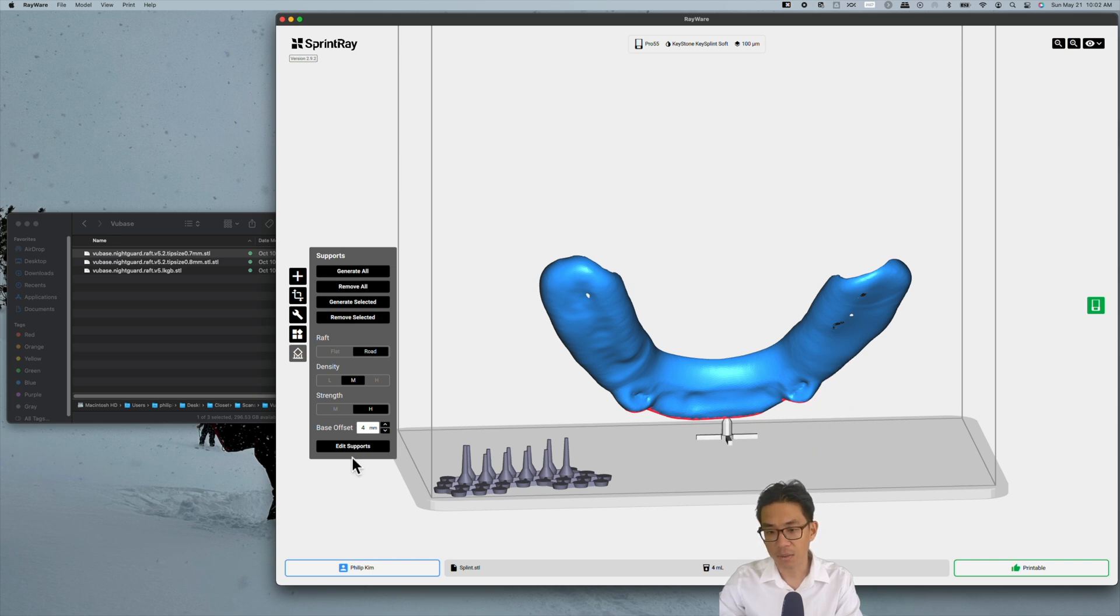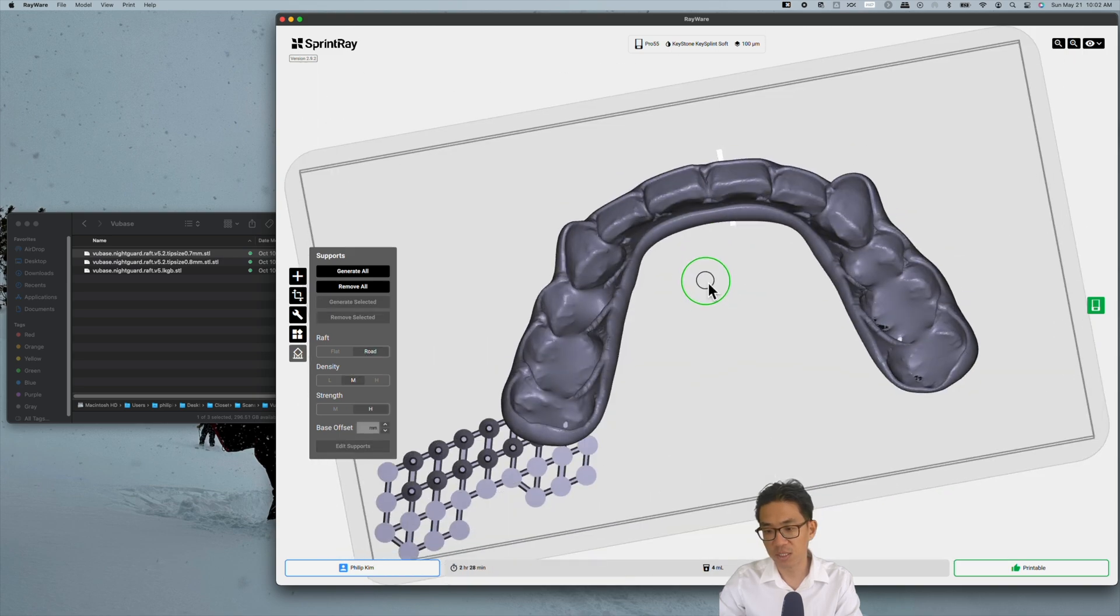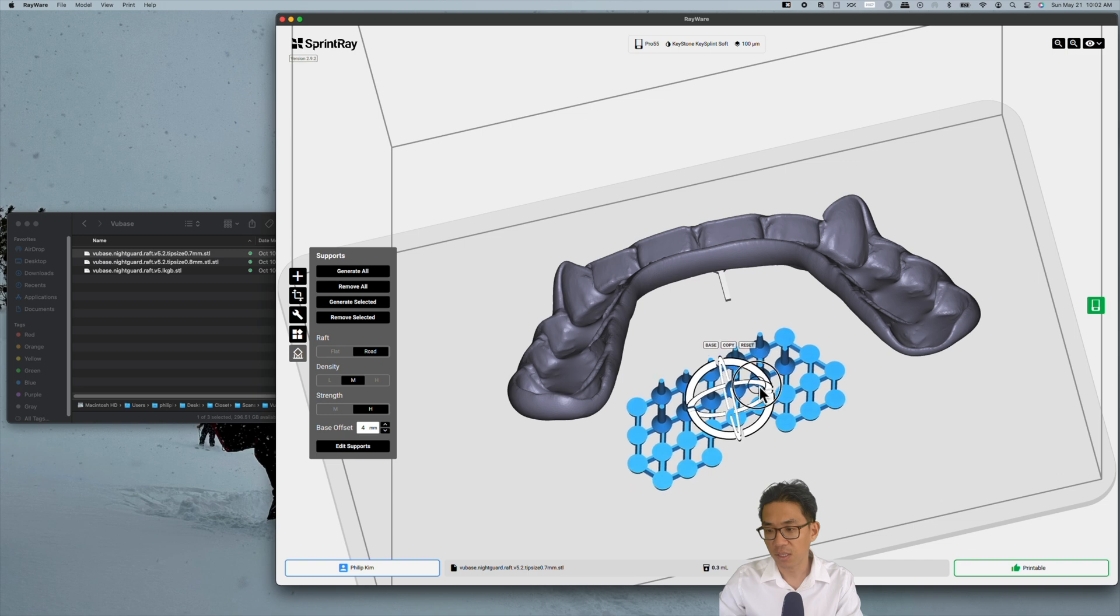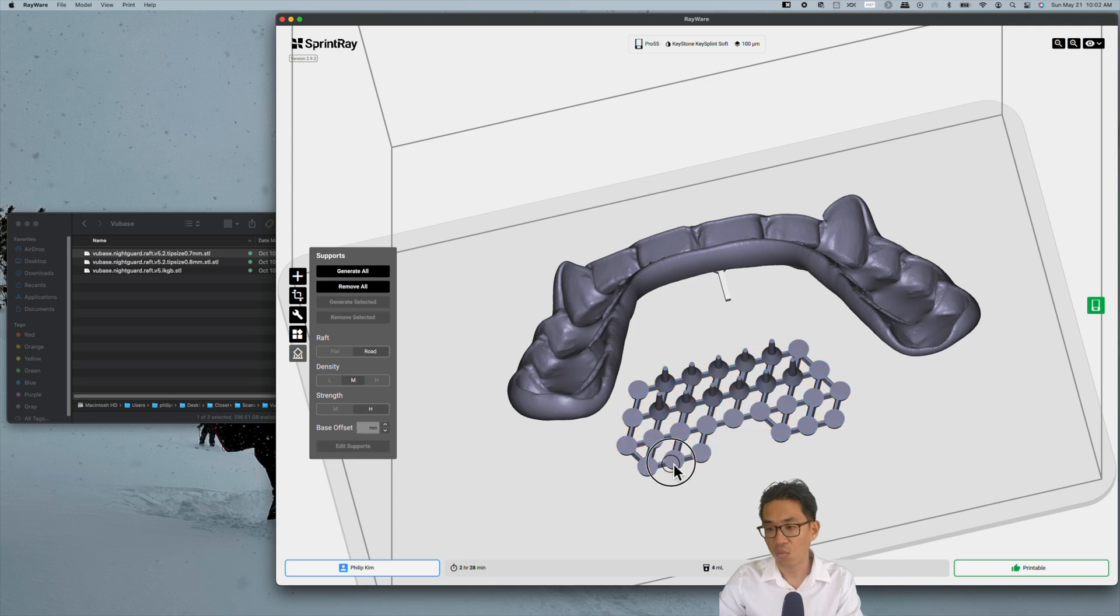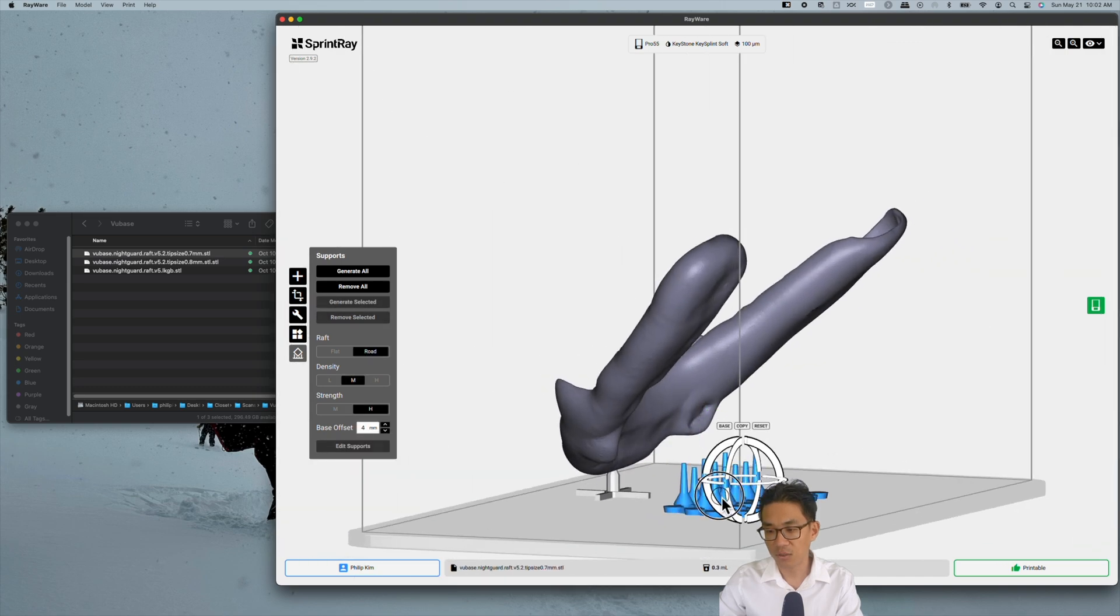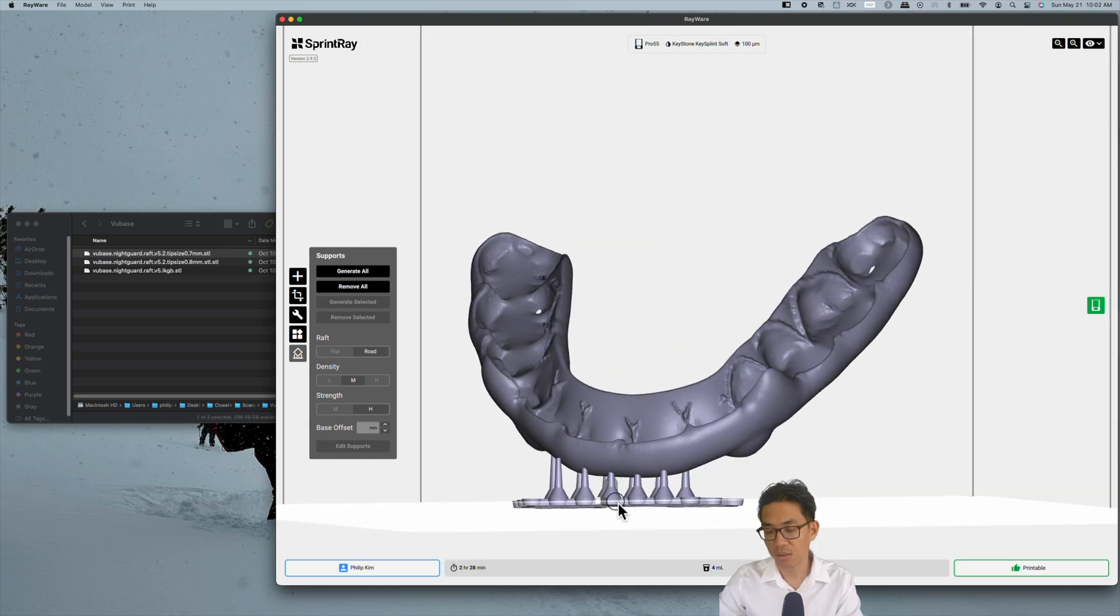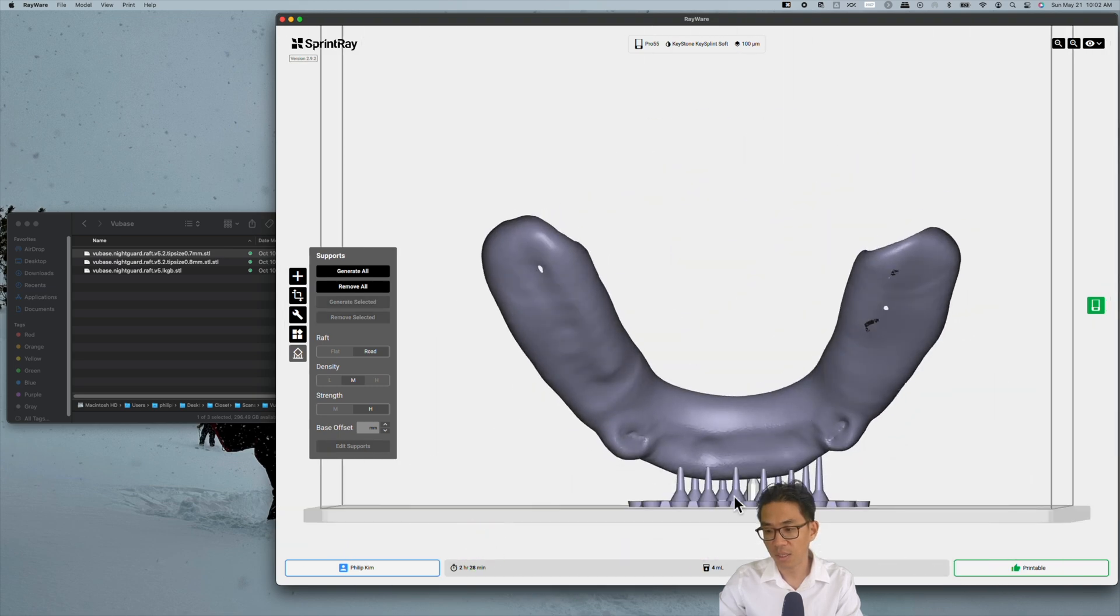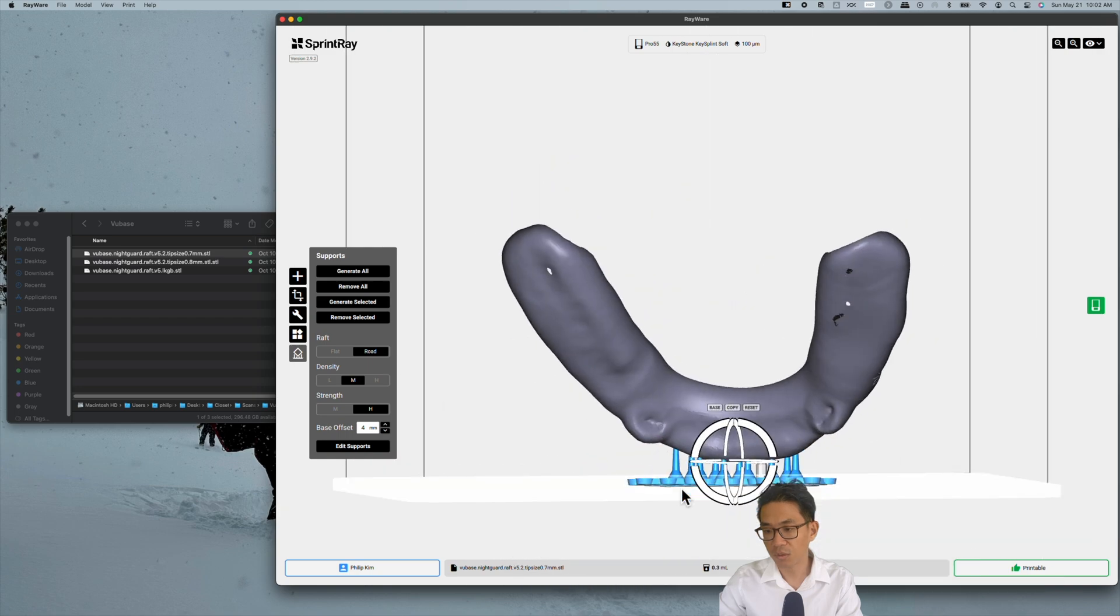Now hit edit supports. Click on the VuBase here and you can angle it so it's in line with the night guard. What this allows for is that you take it and you just place it on the anterior portion.